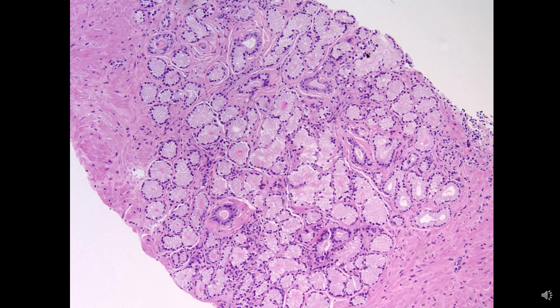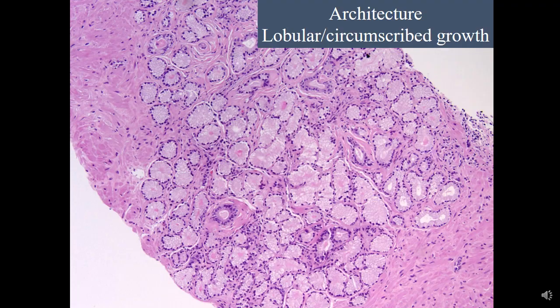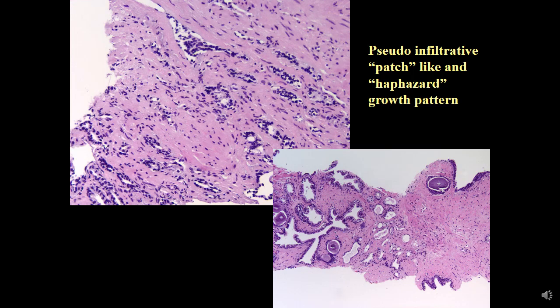Pay attention to this architecture — it is a very tightly circumscribed proliferation. This is usually a mimicker of foamy gland prostate adenocarcinoma, and cancer typically never presents with such a tightly circumscribed proliferation. This rule applies for most benign conditions, but be aware that atrophy can present with a patch-like or pseudo-infiltrative growth pattern, and partial atrophy and some other benign mimics can present with a haphazard or disorganized growth pattern. However, these patterns are not the infiltrative pattern characteristic of prostate cancer.